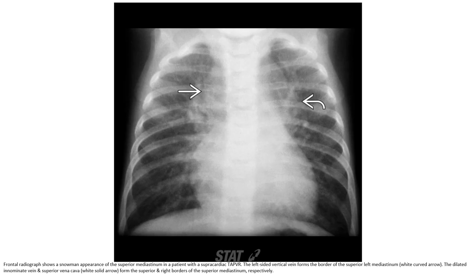This is the chest radiograph showing the snowman appearance of the superior mediastinum in a patient with supracardiac TAPVR, where drainage is above the diaphragm, forming the characteristic snowman silhouette.